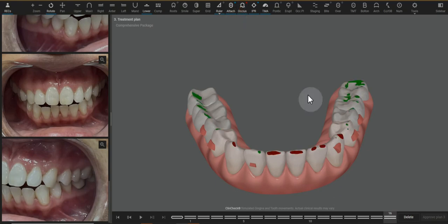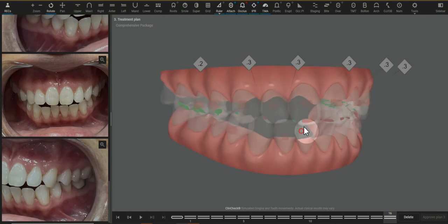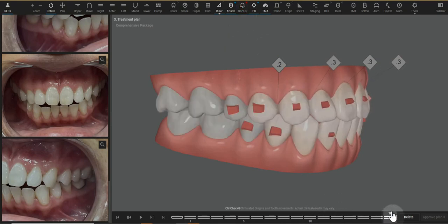As far as bite goes, you can see this is finishing with a heavy anterior contact. This is theoretical, because this part of the ClinCheck is really just a tool to give a guide of where these teeth may connect with each other. If we're starting with an anterior open bite, I would rather, on the ClinCheck, over-treat that.